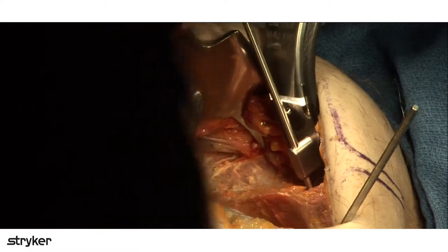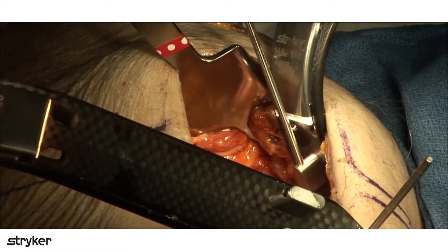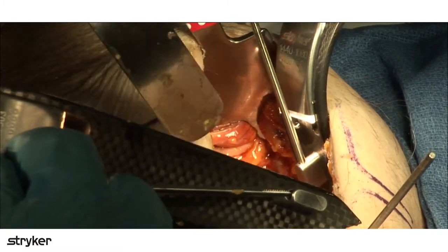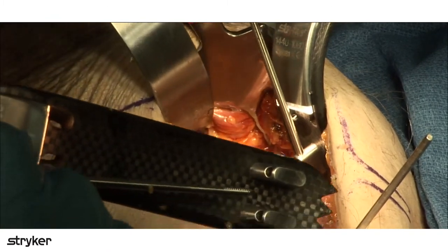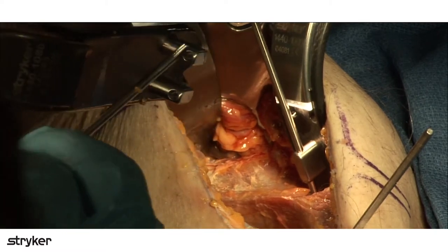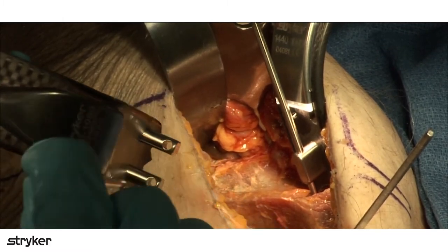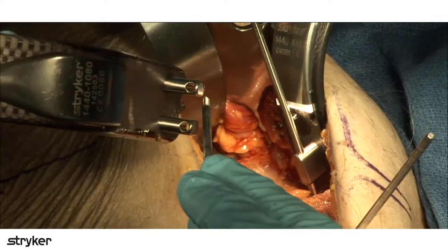So you'll notice on this retractor here that it has 2 K-wire options, I guess, if you want to call it that. And depending on what side, it doesn't mean you need to put 2 in there. I guess you can if you want. But basically, whether you're on the left side or the right side, you're going to put 1 in. You want to put the stabilizing K-wire into the hole that's most lateral. So if you're on the right side over here, I would use this one. If I'm on the left side, I'm going to use that one.